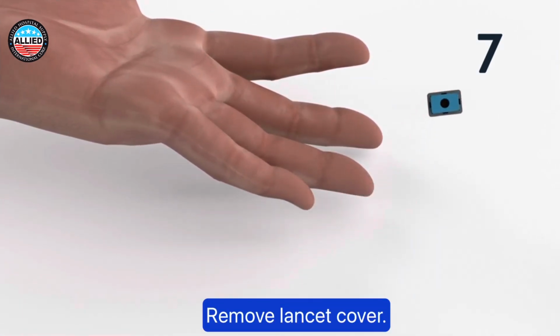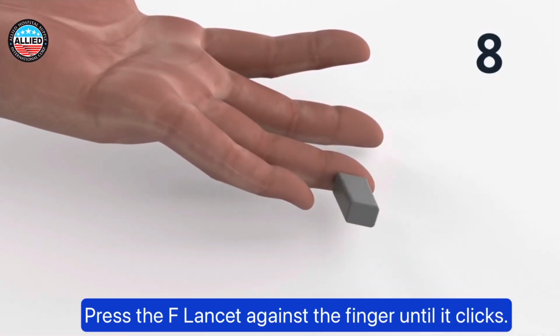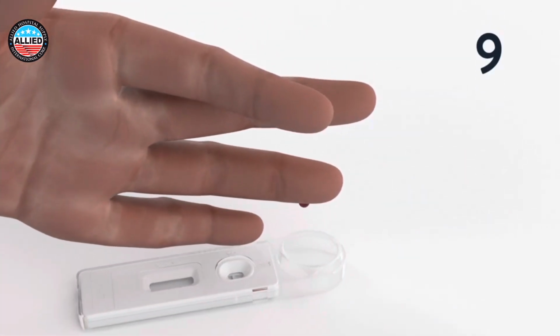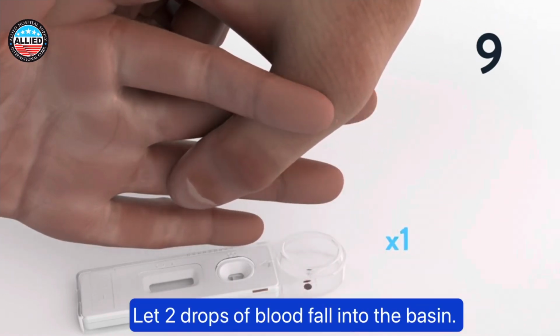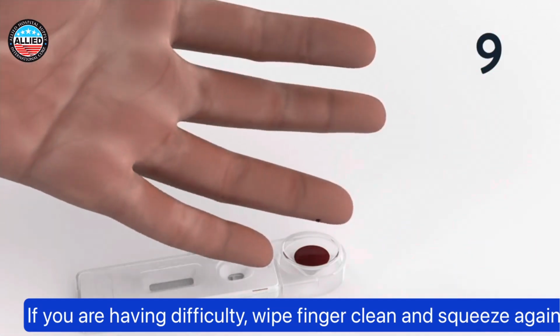Remove lancet cover. Press the F-lancet against the finger until it clicks. Massage from the base to the tip. Let 2 drops of blood fall into the basin. If you are having difficulty, wipe finger clean and squeeze again.